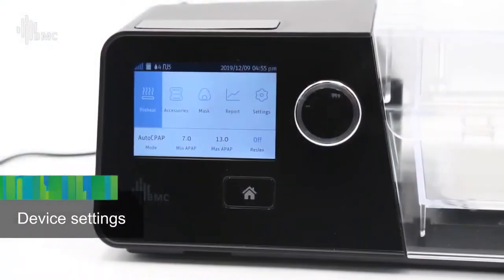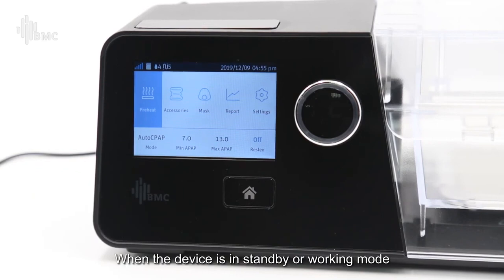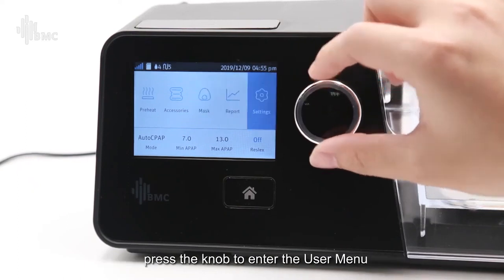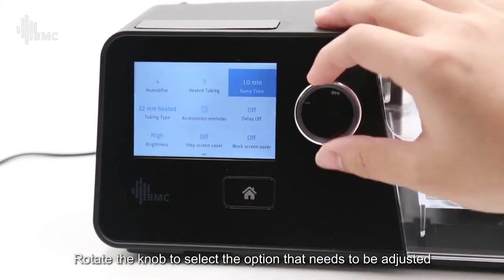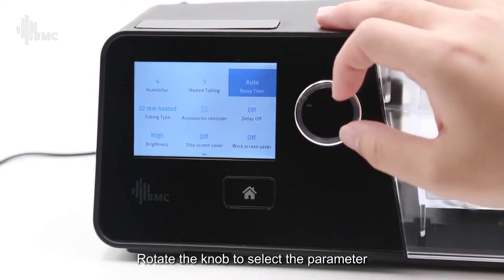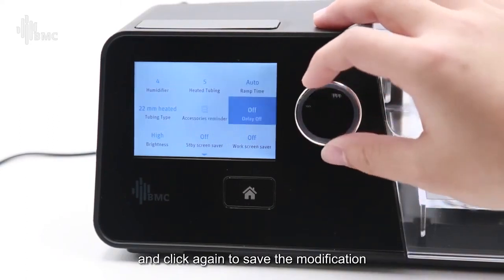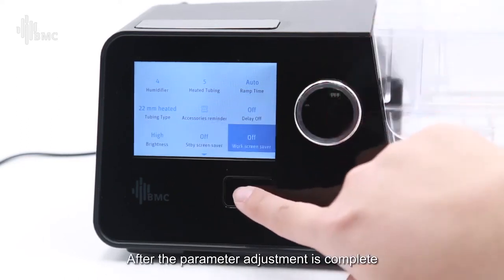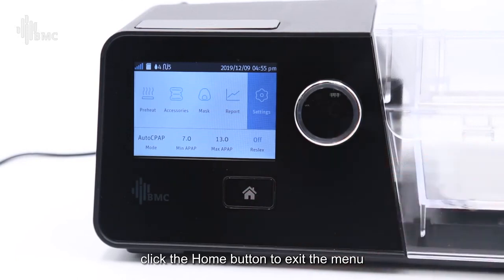Device settings. When the device is in standby or working mode, rotate the knob to move the cursor to the settings icon. Press the knob to enter the user menu. Rotate the knob to select the option that needs to be adjusted. Click to select. Rotate the knob to select the parameter and click again to save the modification. After the parameter adjustment is complete, click the Home button to exit the menu.